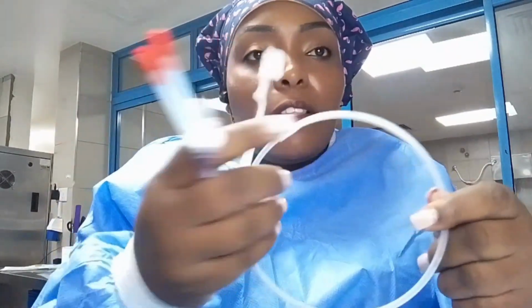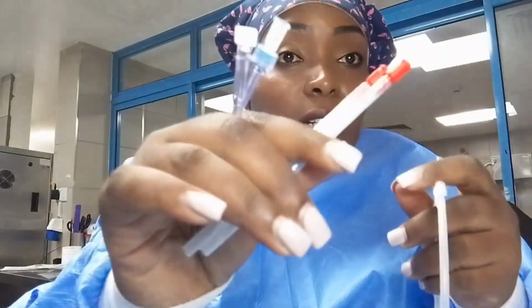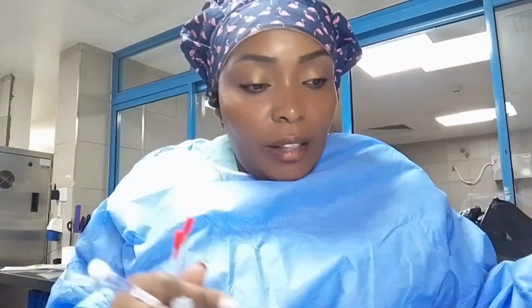Let me show you the guide wire. This is the guide wire. So the finder needle first, then the guide wire comes second, then the dilator. Then after that, the flush to prime your central line.